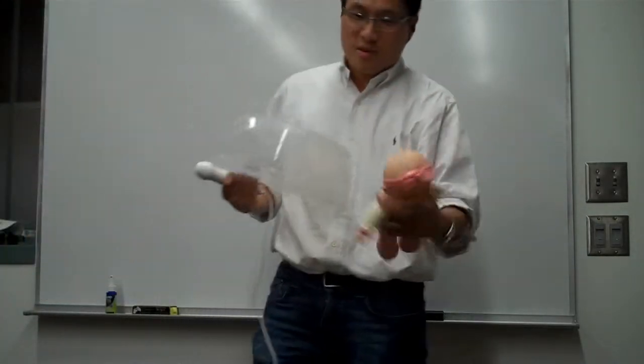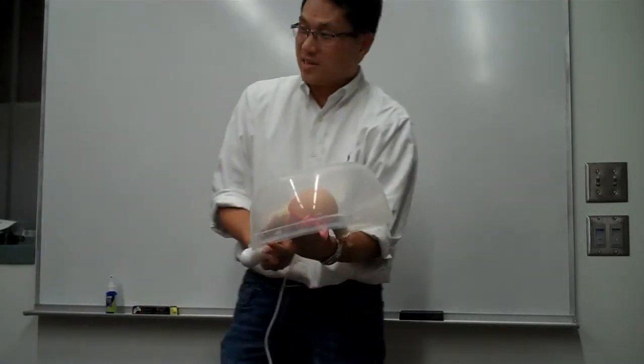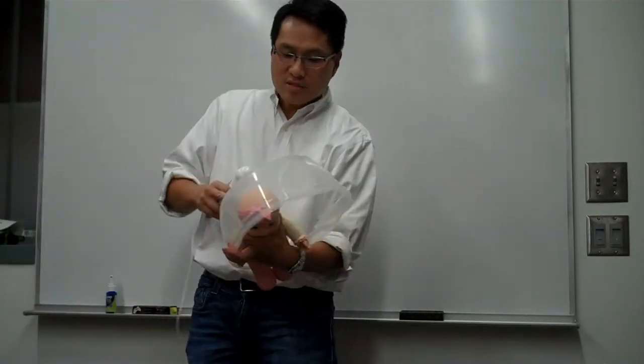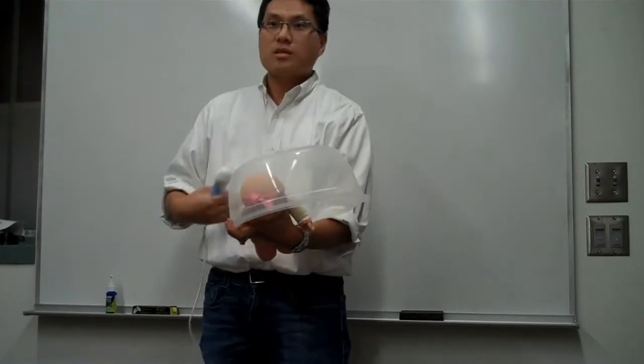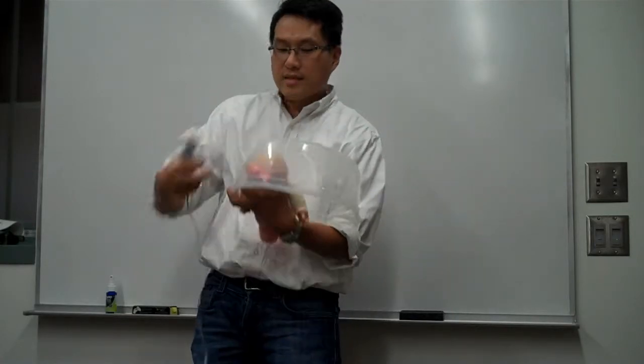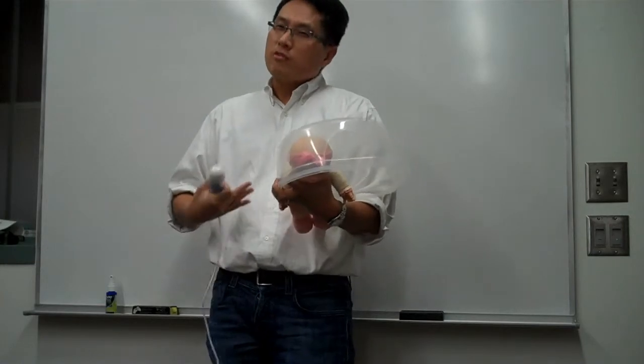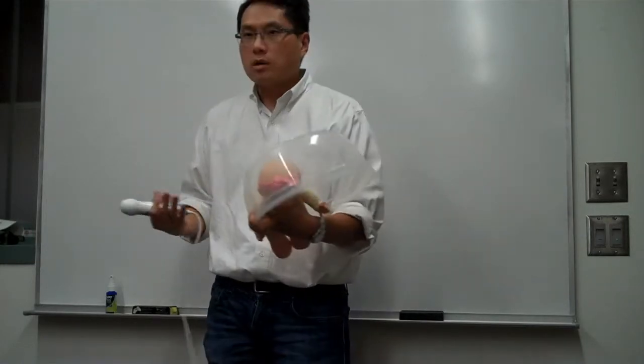Sorry, baby. I will use this baby. So a real baby, and let's say this is the abdomen, covered with some sort of covering to simulate the mother's womb, right? The mother's abdomen. So we're going to be scanning like this, and the in-between has to be some sort of gel or fluid. You know, in real life, there's amniotic fluid, which is pretty much water.